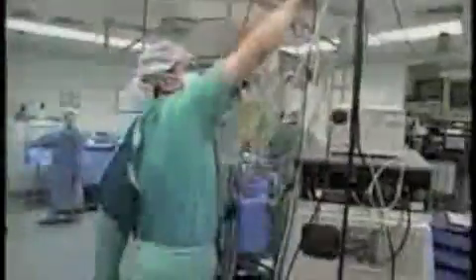In addition, users may have problems recovering from errors. And finally, in a crisis or unusual situation, the device's use may, in fact, make the situation worse. A real problem in the operating room is the large number of cables and wires that are not only a tripping hazard, it's not uncommon to forget to plug something in and the battery runs out, or to plug in the wrong thing, to attach the wrong device to the wrong cable. And these are obviously clear usability issues.